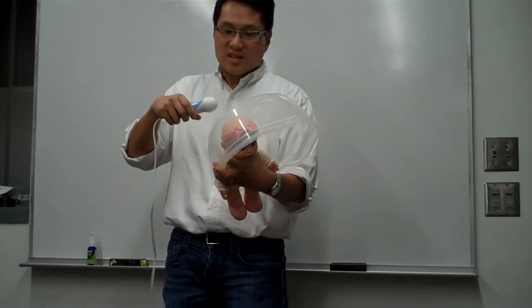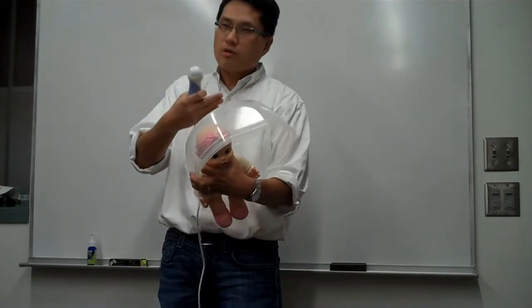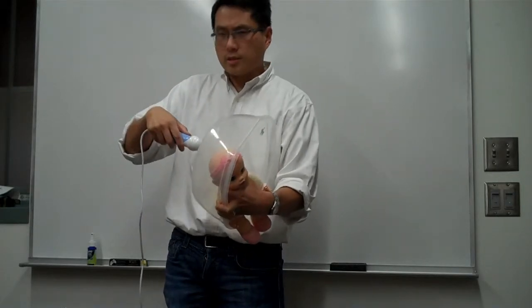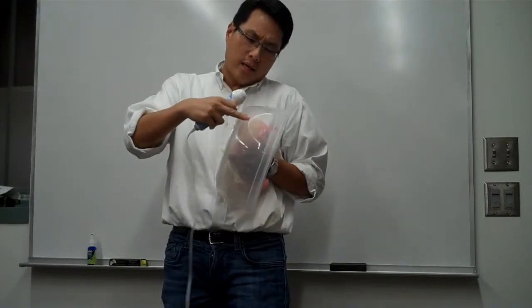I have an ultrasound machine. You have to put a little bit of gel. Basically, you need to get rid of all the air pockets. Okay. And then the other thing is, the probe has a certain depth. So you don't want the baby right at the top.